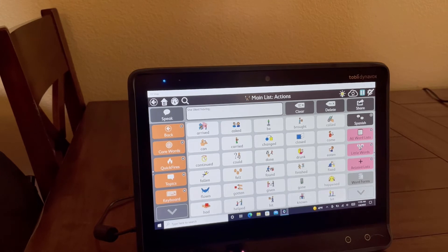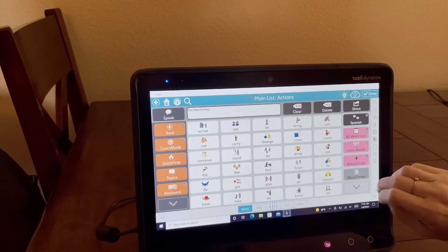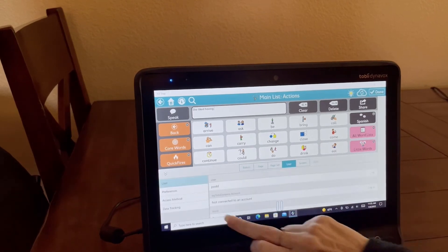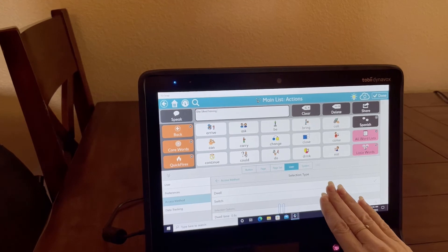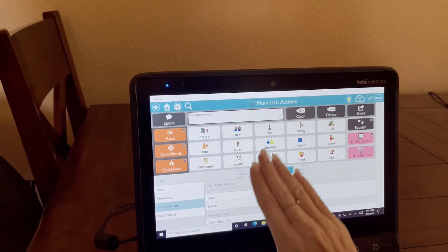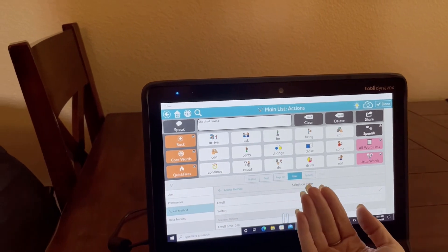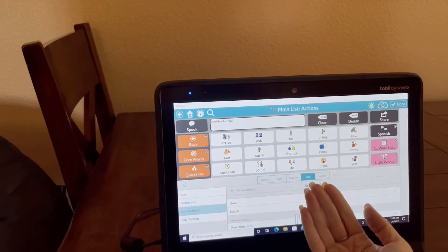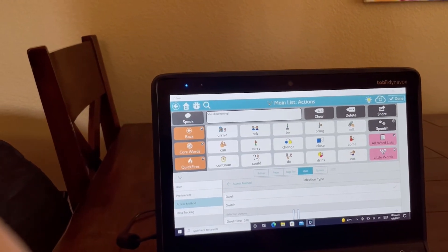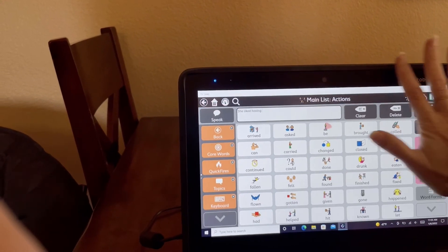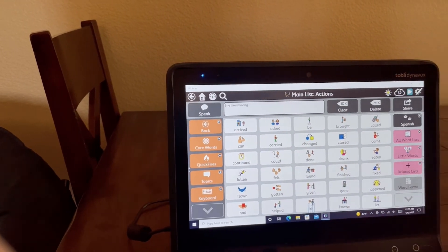If you want to change the dwell time, go into the user settings, then access method, and the dwell time is there. The dwell time needs to be set short enough that the user can be still for the clock to go all the way around, but long enough to look at the language, process whether they want it, and move off before it activates. That is the general setup for the Tobii Dynavox Eye Gaze Access Method.